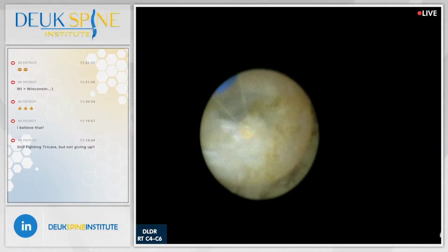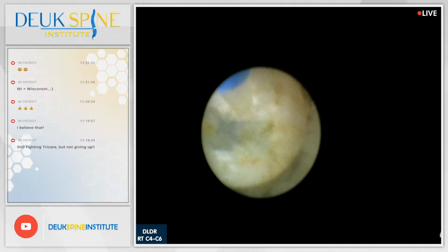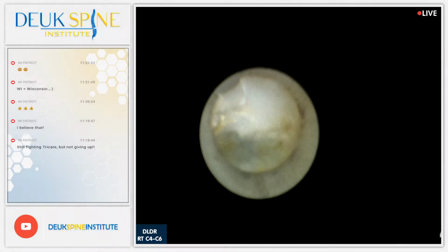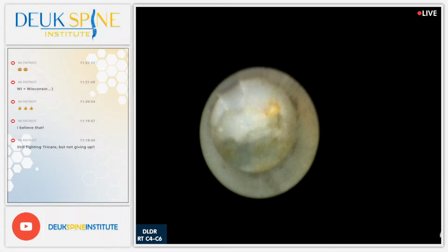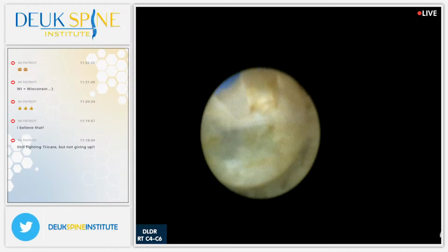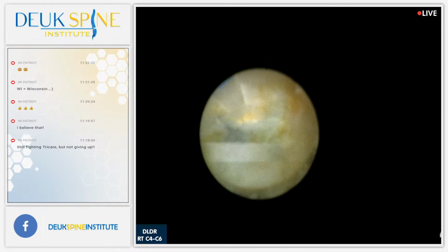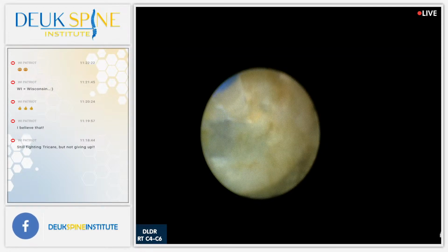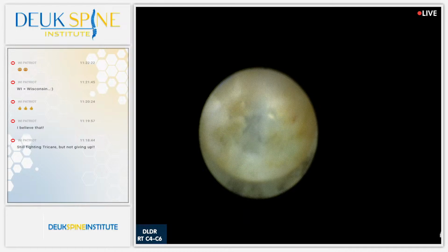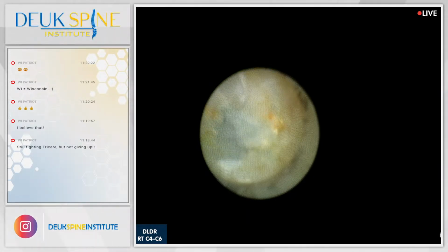But it'll take 9 months. You guys notice how the tissue's all white? It's white because there's no blood supply. There's no arteries, veins, capillaries here. This annulus is avascular. It has no blood supply, which means it takes a really long time to heal, and it heals through diffusion. Diffusion is the movement of things across concentration gradients, right?